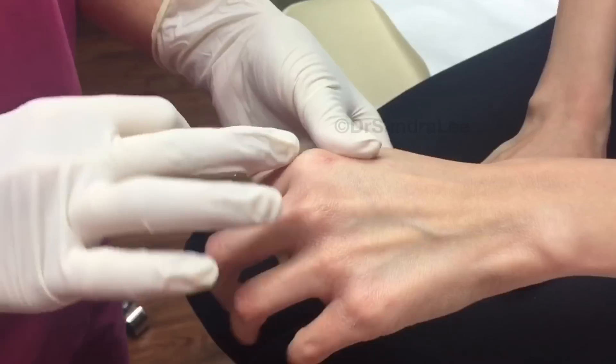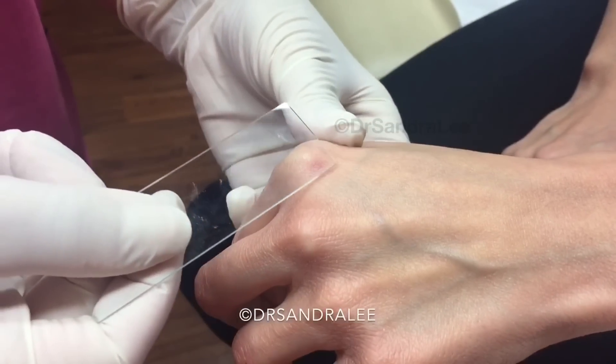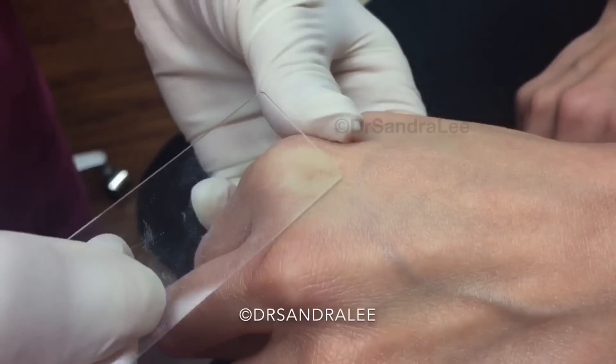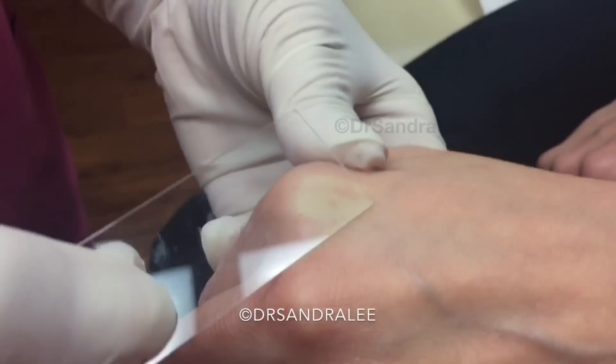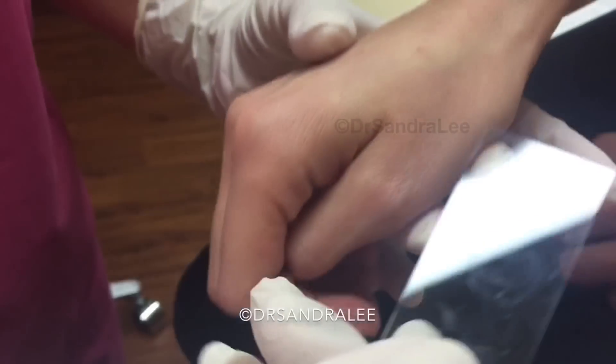On the hand here, this is called a nevus araneus — it's just a little blood vessel. You can tell it's a blood vessel because when you use a glass slide to press on it, it blanches and completely goes away, then kind of flushes back. That's how we know it's blood. And on this side you have another one, a little one.